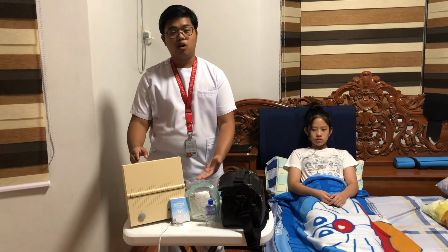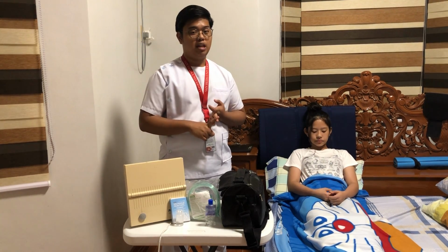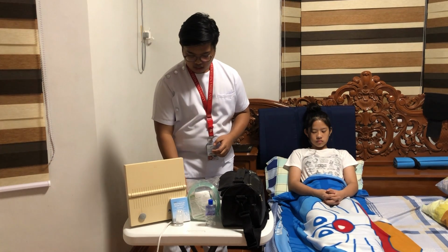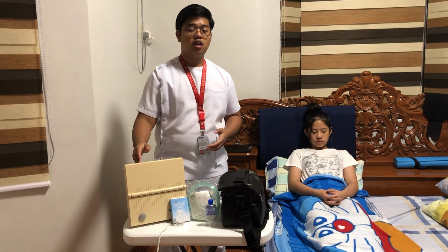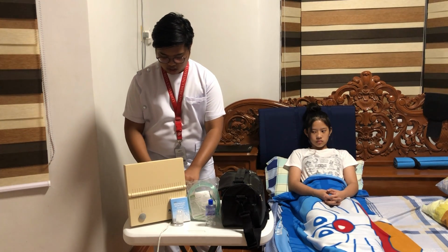I will be demonstrating the nebulization process. Before anything else, the first thing that we need to do is to gather appropriate equipment, including the appropriate aerosol device, which is in the form of a generator that can either be a small volume nebulizer, a large volume nebulizer, or an ultrasonic nebulizer. And then after that, we need to secure the power source, which we have here, that serves as the mechanism by which the generator operates or is actuated. So we're going to plug in our nebulizer.